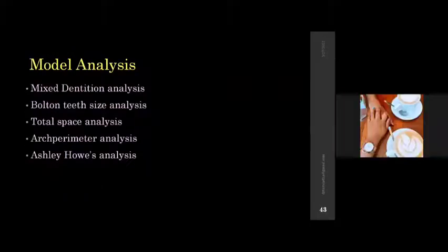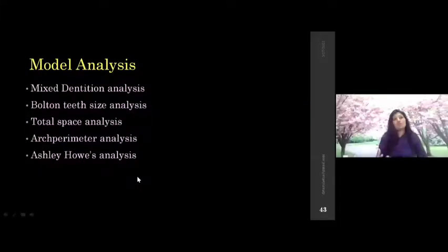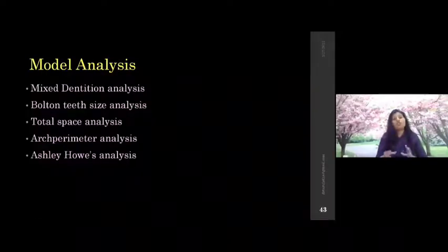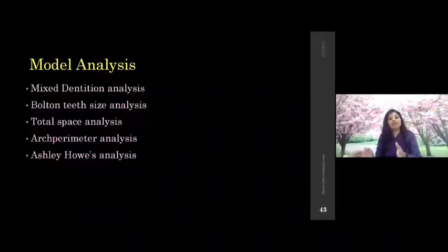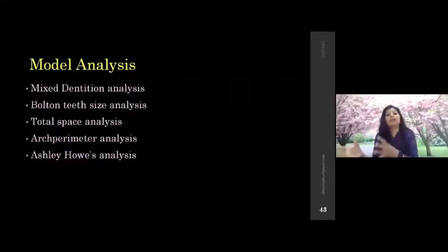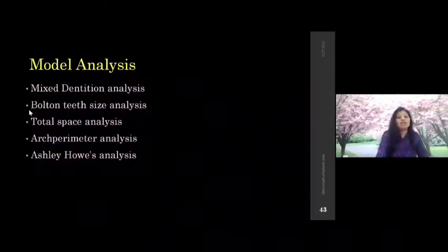Model analysis, you're supposed to do all these model analyses so that you come to know about the phase of the treatment, whether you want to do only myofunctional appliance treatment, or else you want to continue to the second phase, that is the fixed orthodontic appliance phase also. Is it needed or not? That is what is to be diagnosed by doing your model analysis. So do your model analysis before taking up a case.